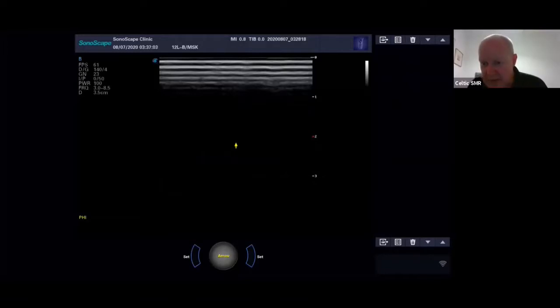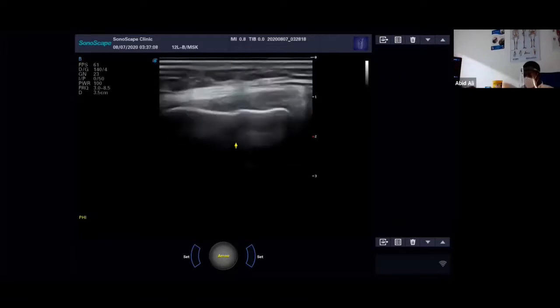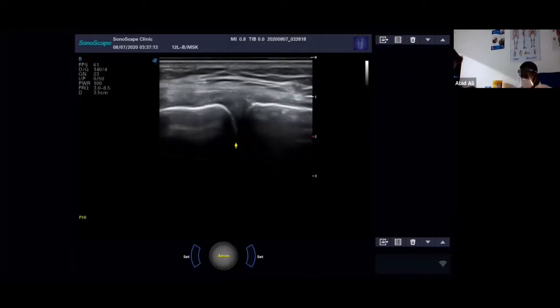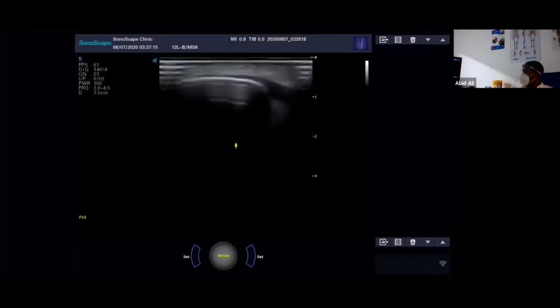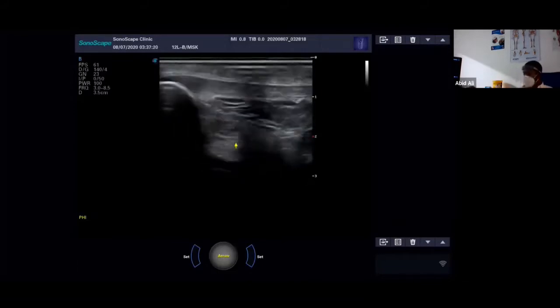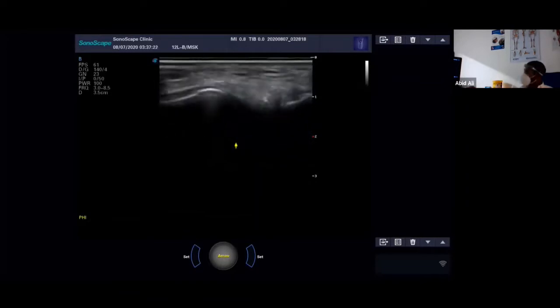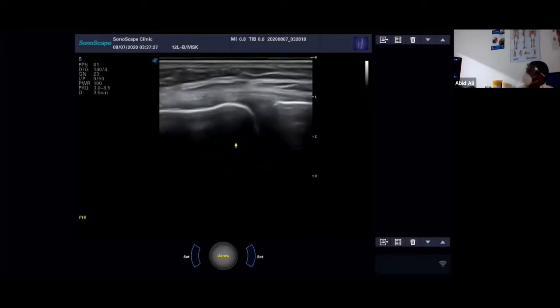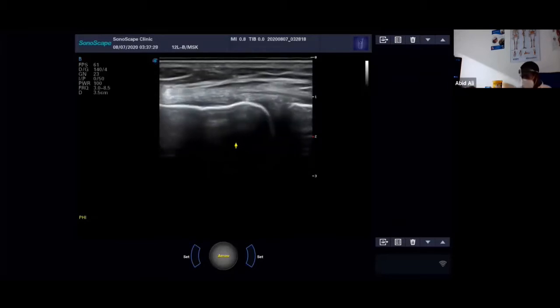Any more questions coming in there, Steve? I have got a couple of... Just to overview then, so typical medial lateral knee exam. Probe placement as close to the... Well, actually, I'd normally place my probe on the patella, actually, and then... Oh, do you? Yeah, just to give myself that bony landmark. Yeah, so you've got the patella tendon, yes, and then you just roll off. Just roll off, and then should be equally good. It's just because, like I said, sometimes you're in the deep blue sea, just moving around if you're not quite.